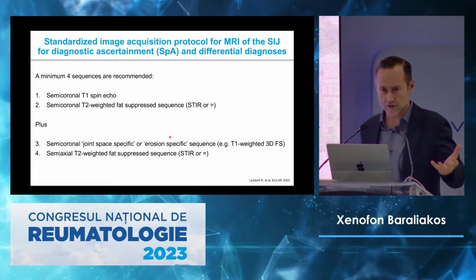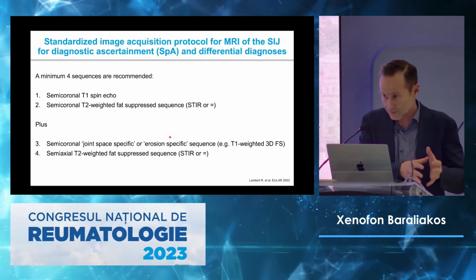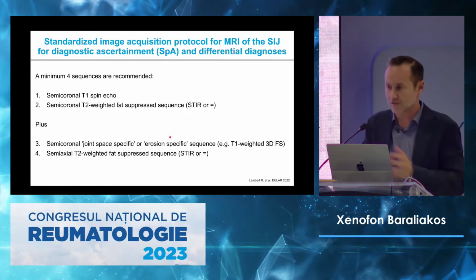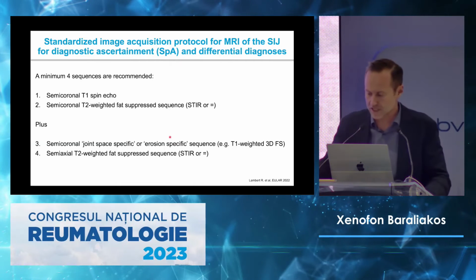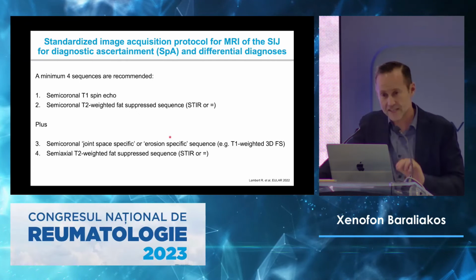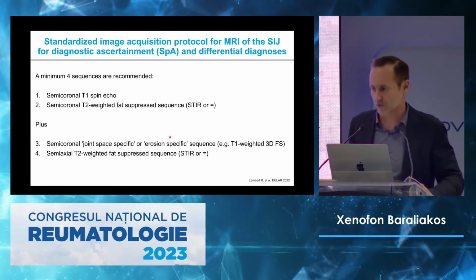So we have the baseline MRIs and the 2-year MRIs. At baseline, you have fat and inflammation, and then you see the syndesmophyte at the end. But whether that inflammation has developed fat in the meantime, we don't know. That's why we say if you see someone now and has inflammation, the risk for developing syndesmophyte is the same as if that patient has fat after 2 years, because we don't know what's happening in between.